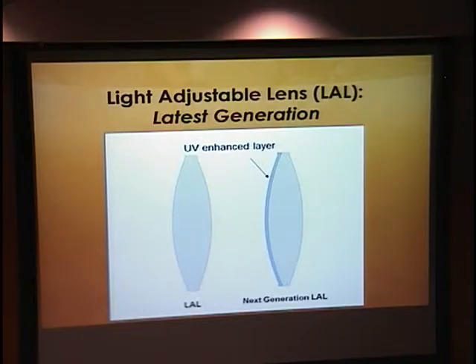The idea behind this is that if you can thin it out, you can perhaps make it so that you don't need that many adjustments. If you don't need that many adjustments, you might shorten the time after implantation of the lens down to about 2 weeks before you are able to lock again. This helps with patient compliance, because as y'all can imagine, asking a patient to wear UV protection for 4 weeks is a big thing to ask.